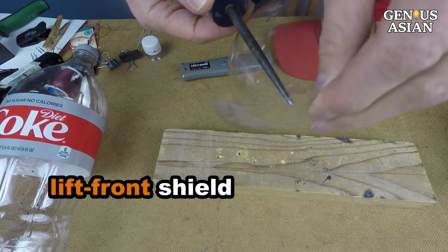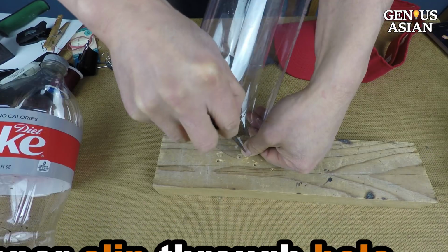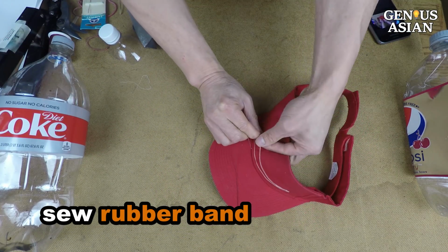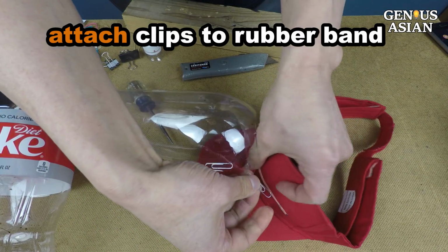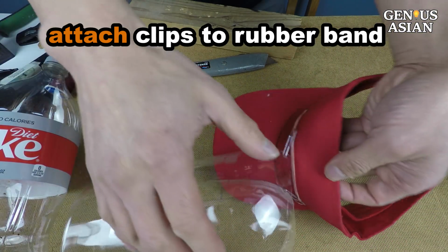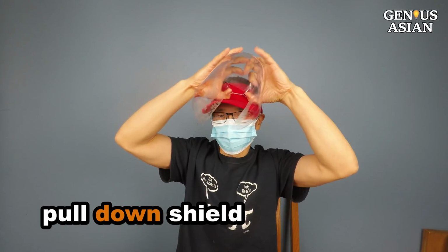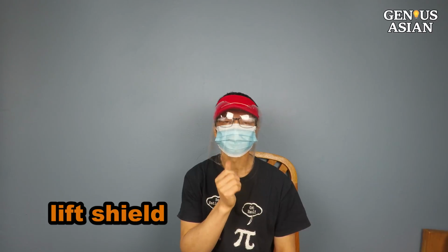The next design is a lift front shield. I drill a hole on each side of the shield and put a paper clip in through each hole. I sew a rubber band on this visor. Attach the paper clips to the rubber band. Wear the visor as you normally do first. Then you can pull down the shield. See, it works. When you want to lift the shield, you just pull the shield up.